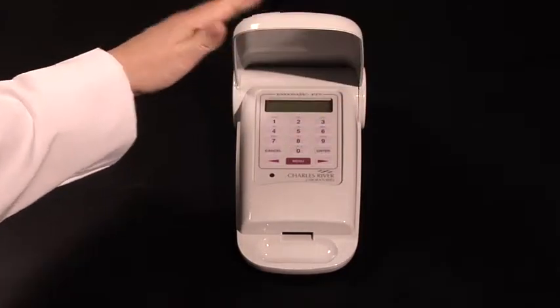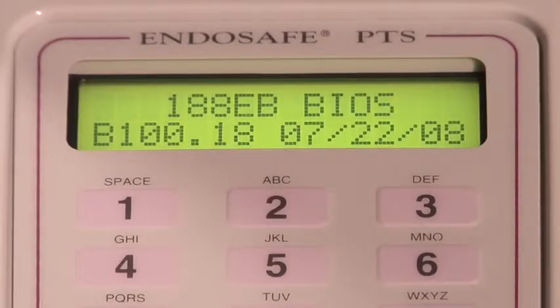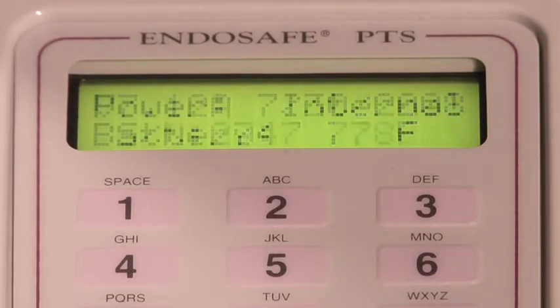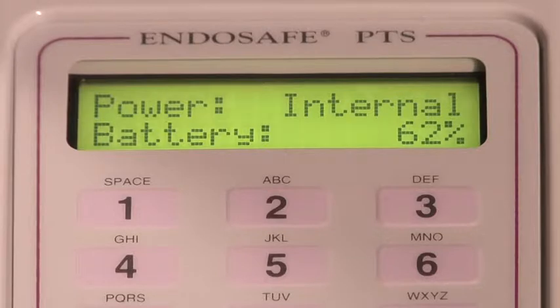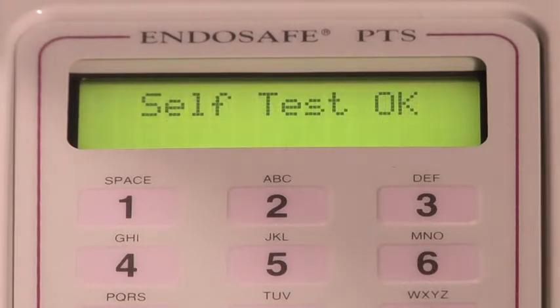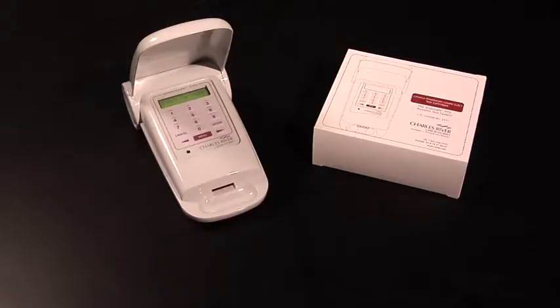To begin the process, turn the PTS reader on by pressing the MENU key. After pressing the MENU key, the reader begins a system self-test and will take approximately five minutes to reach the appropriate 37 degrees Celsius. Once the reader reaches this temperature, the display will change from system self-test to insert cartridge. You are ready to begin.